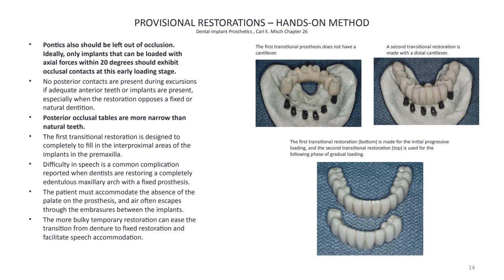First of all, it gives us a sense of how the final restoration is going to look. So the dentist is going to see how we design the final restoration. The patient is going to see how he or she is going to look with the final restoration. This is the time where we can make any adjustments. If the patient doesn't like the shape of the teeth, it's easy to change it in acrylic and have it ready for the final restoration. So we know when we do the final restoration what the patient desires, right?